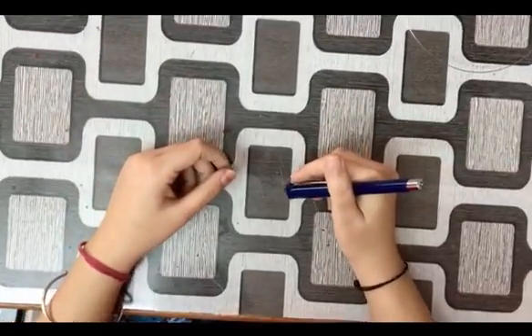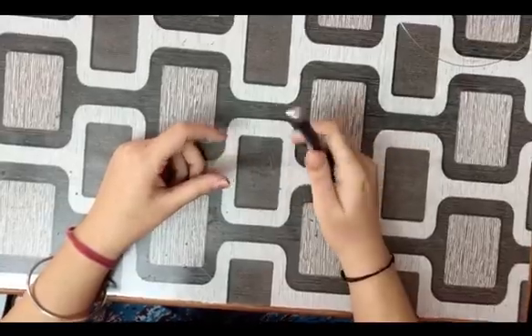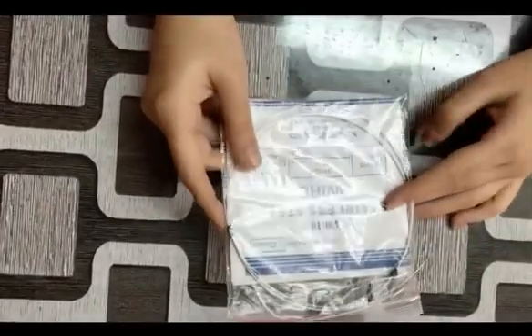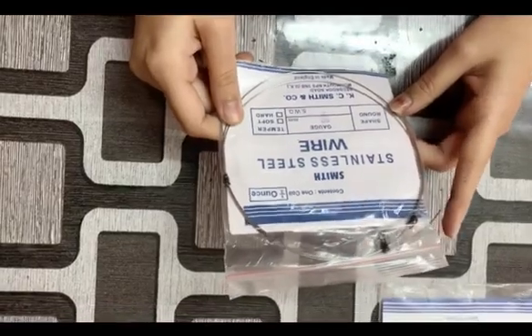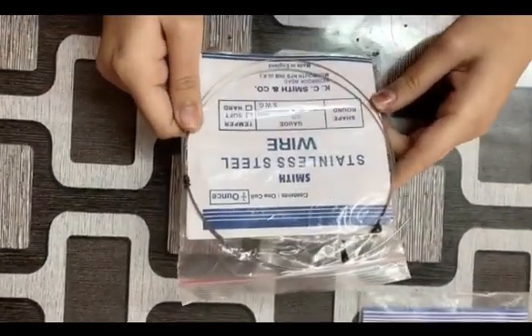Hello guys, hope you all are doing well. I'm back with another video. In this video I'm going to tell you how to straighten wire in five minutes. It is a stainless steel wire which is used to make dental appliances like clasps, bows, springs, etc. It is also called 18-8 wire because of its composition.